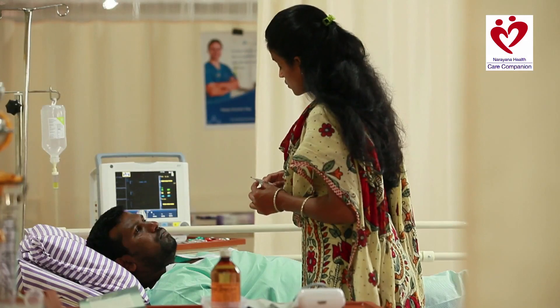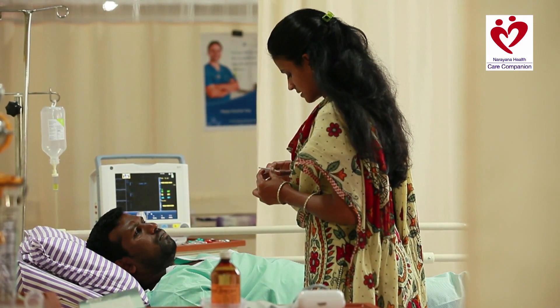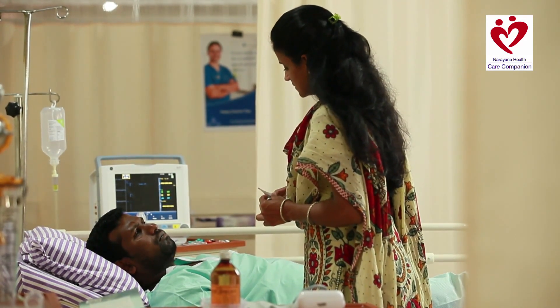It's 38 — slightly outside the normal range of 36.5 to 37.5. I'll still inform the doctor.